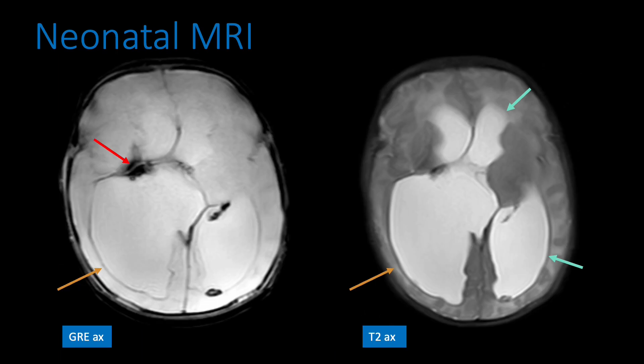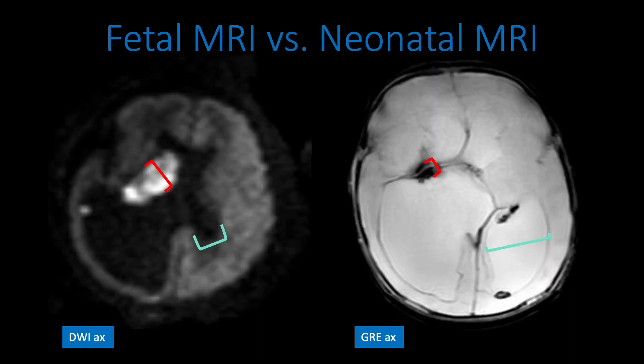Neonatal MRI confirmed fetal MRI findings and demonstrated progression of germinal matrix hemorrhage over time. Axial GRE and T2-weighted images show marked right ventriculomegaly with porencephalic changes and moderate left ventriculomegaly. Blooming signal on axial GRE demonstrates the extent of intraparenchymal hemorrhage. Comparison images showing the fetal axial DWI and neonatal axial GRE demonstrate decreased size of intraparenchymal hemorrhage but progression of ventriculomegaly between time points.